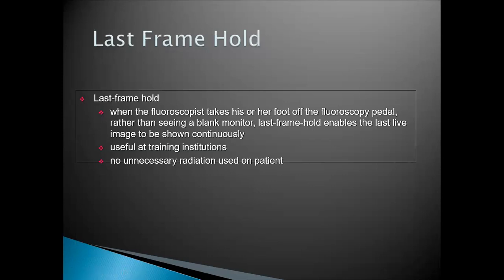So we have last frame hold. This is a very, very wonderful feature in all fluoroscopy machines. The last frame hold has to be there. What does this mean? For example, when one is watching a particular program on television, all of a sudden something happens and the TV goes black. It is not a good feature in fluoroscopy.